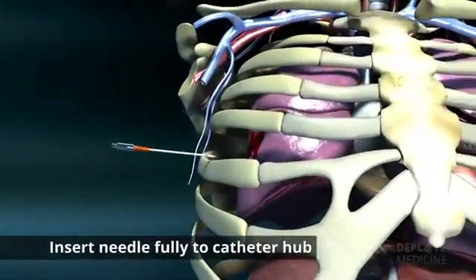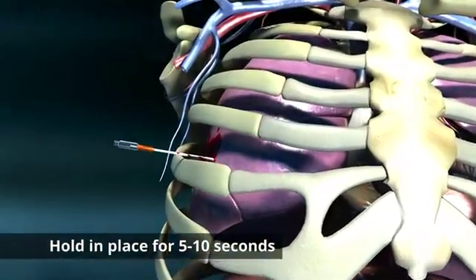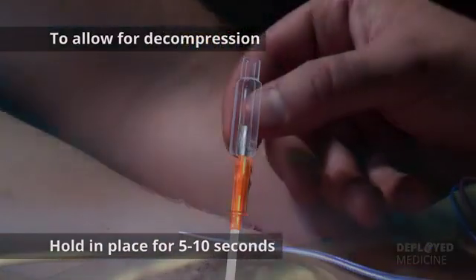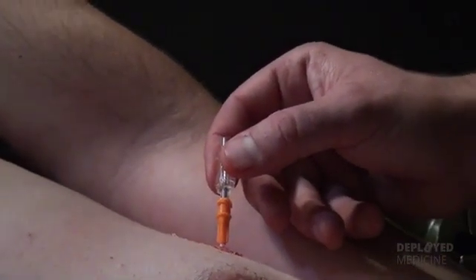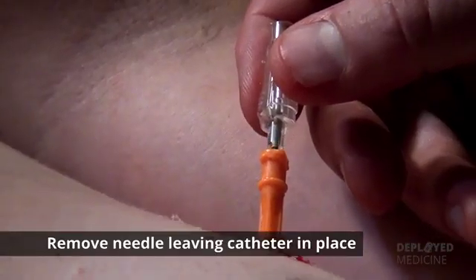Insert the needle catheter unit all the way to the hub and hold it in place for five to ten seconds to allow decompression to occur. After the NDC has been performed, remove the needle, leaving the catheter in place.